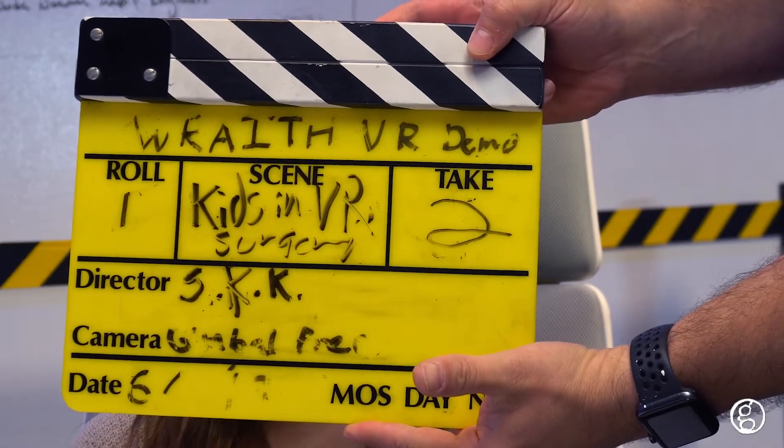Kids and virtual surgery, take two. What's your name? Olivia. And how old are you? 14. Have you ever performed knee surgery before? No, I have not. Do you want to try it in virtual reality? That sounds interesting. All right, let's give it a go.